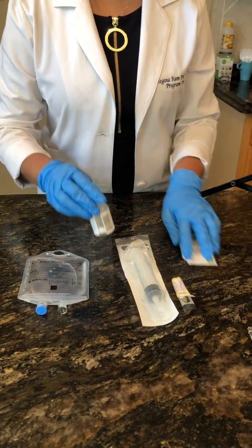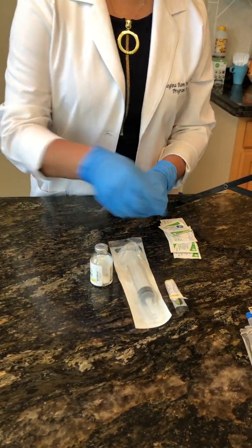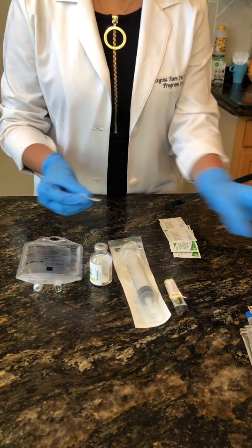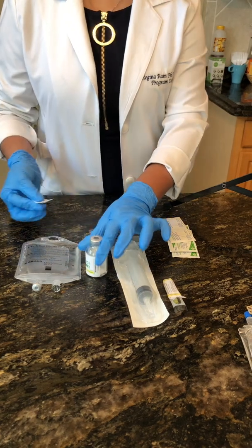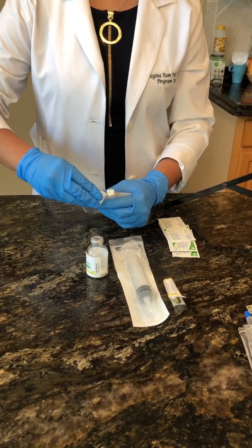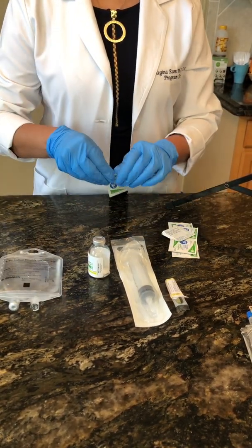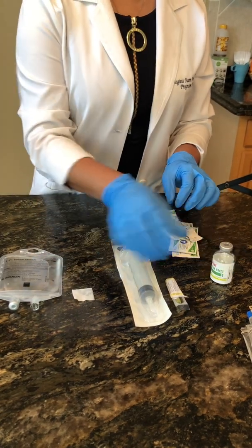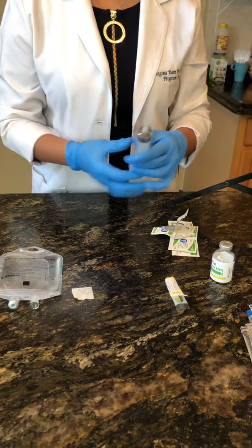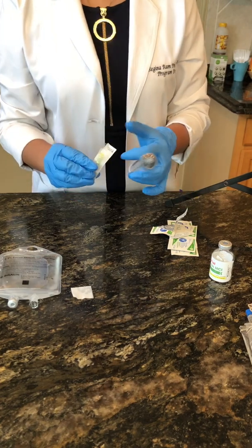The first thing we're going to do is swab the additive ports — use the opposite side of each port. Lay an alcohol swab down. Then go ahead and assemble your syringe, which you may have a smaller one in your kit with the needle.